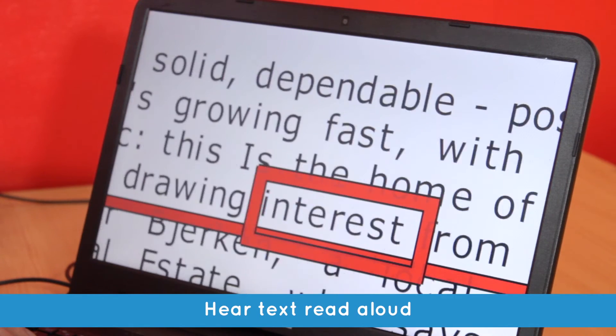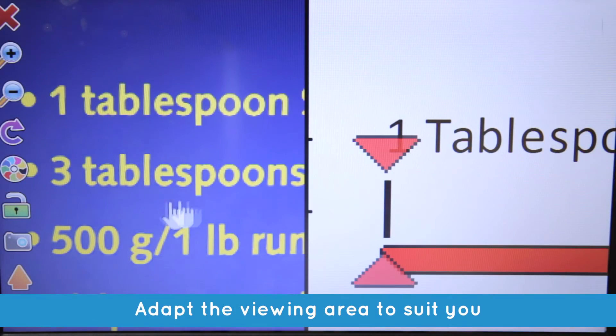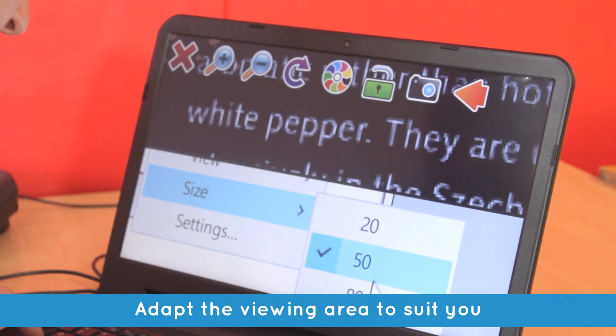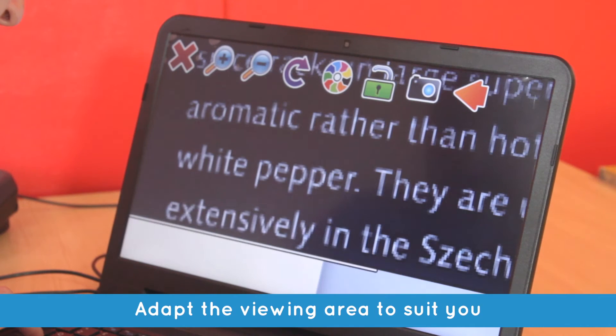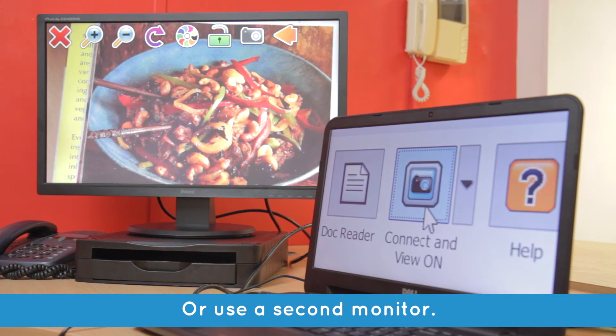Stockholm is drawing interest from other parts of Sweden. Multitask by positioning the viewing area on any side of your computer screen and fill a small or larger proportion to suit your task. You can even place your viewing area on a second monitor.